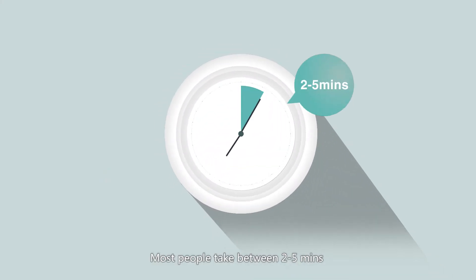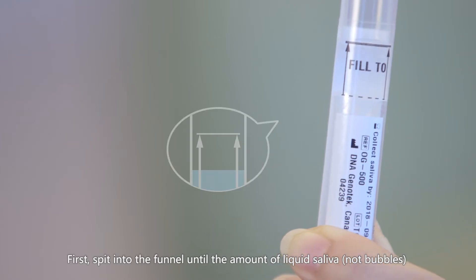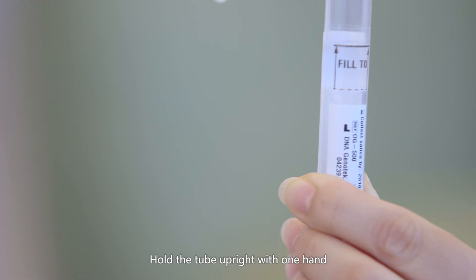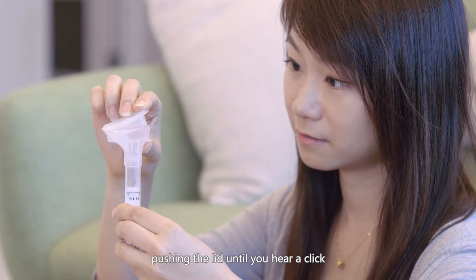Most people take between 2 to 5 minutes to complete the sample collection process. First, spit into the funnel until the amount of liquid saliva, not bubbles, reaches the fill line shown on the tube. Hold the tube upright with one hand.